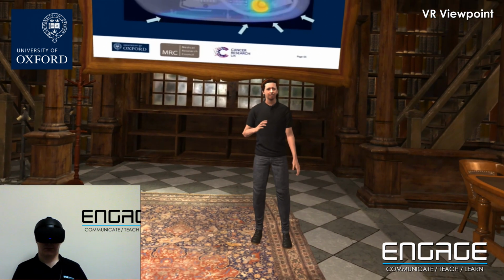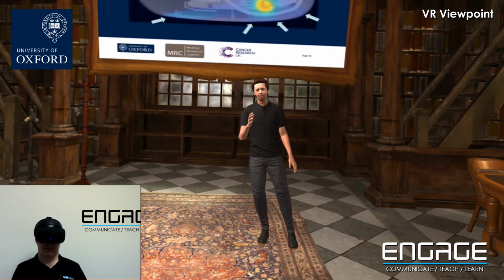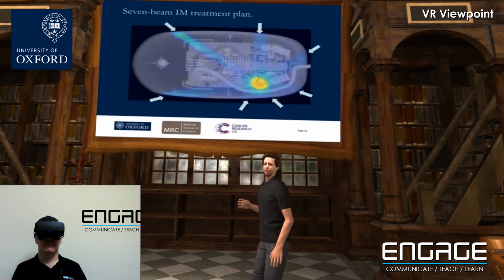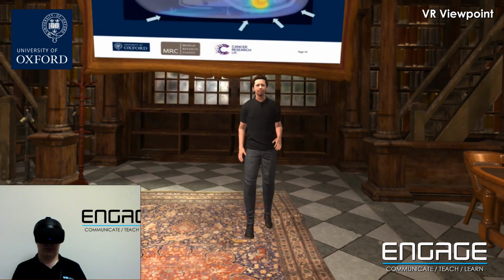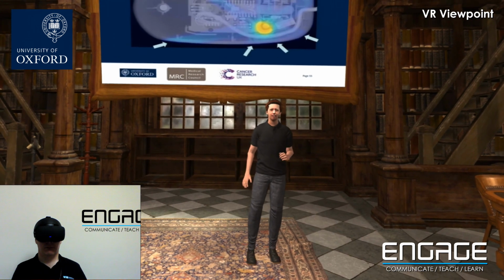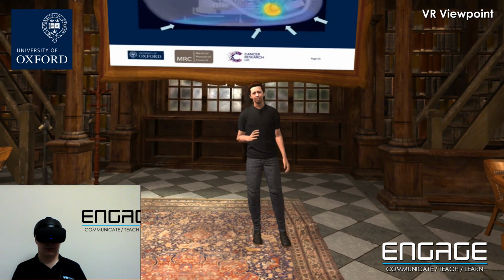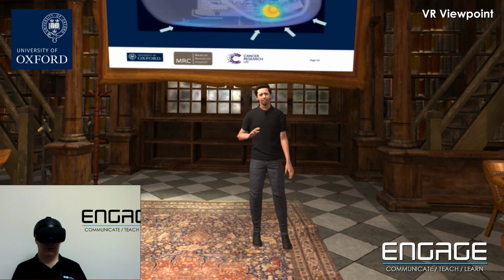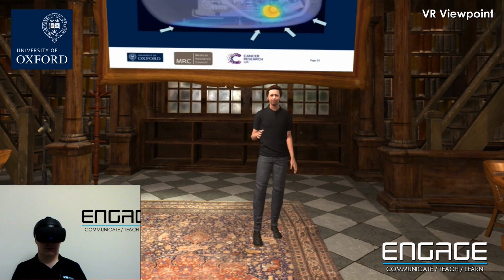Those of you who have sharp memories will remember that I described the tumor as the semicircle. I didn't describe that circle as part of the tumor. That circle is potentially a healthy organ that I don't want to damage. And using an X-ray beam, I'm really struggling to pull that little circle out of the radiation field. Is there a trick we can play that saves that little circle?